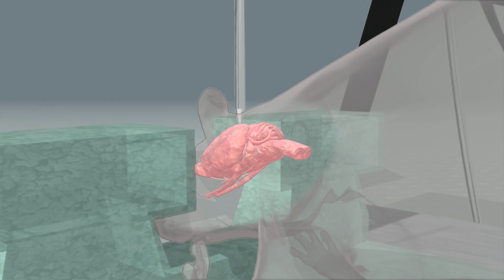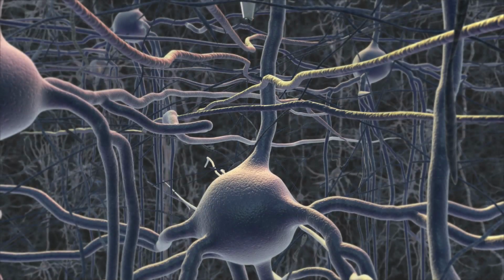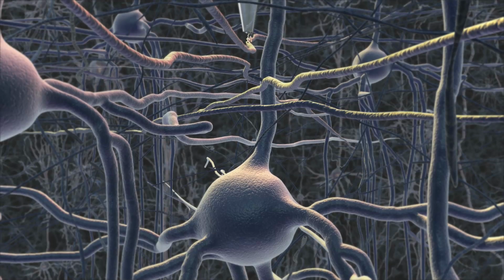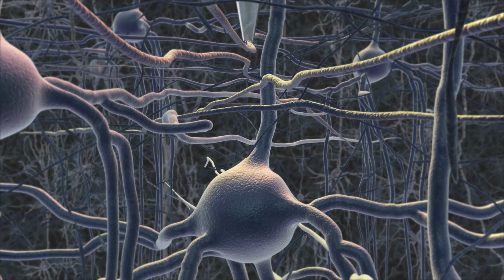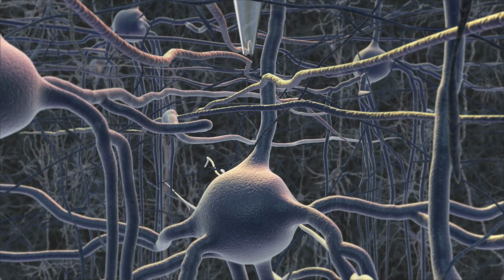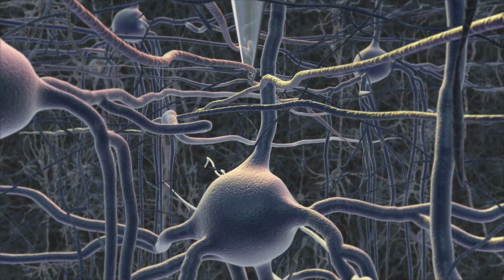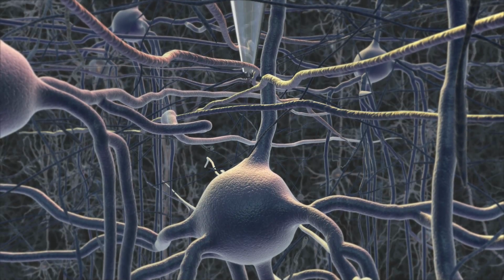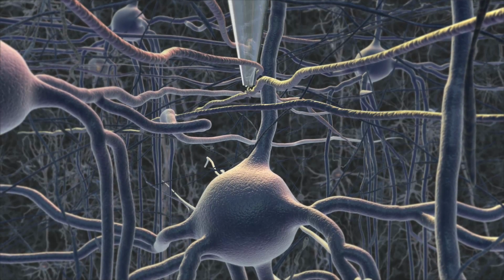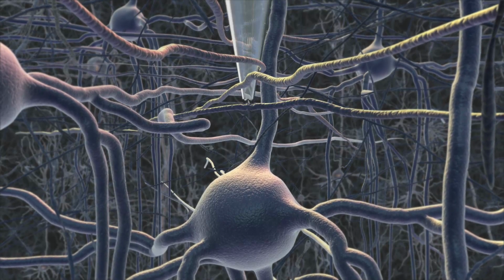The robot lowers the pipette into the brain, looking for a cell to record from. Pressure is applied to the inside of the pipette so that it constantly ejects a small amount of liquid to keep the tip clean. It detects cells by delivering small pulses of electricity while the pipette is lowered in small steps, each about 1/1000th of a millimeter long. When no neuron is present, the pulses of electricity diffuse away into the brain. When the pipette is close to a neuron, however, the neuron blockades the flow of electricity.